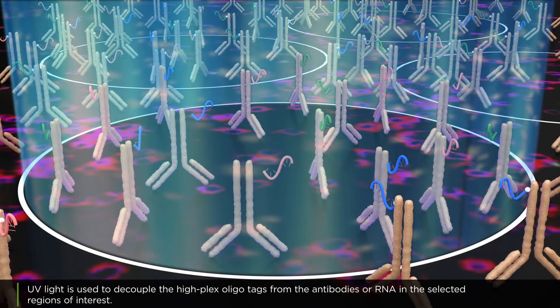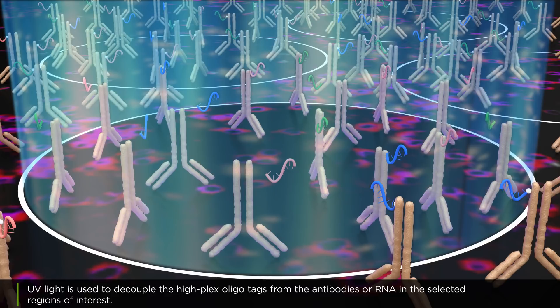UV light is used to decouple the high plex oligo tags from the antibodies or RNA in the selected regions of interest.